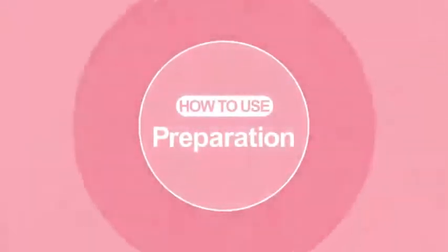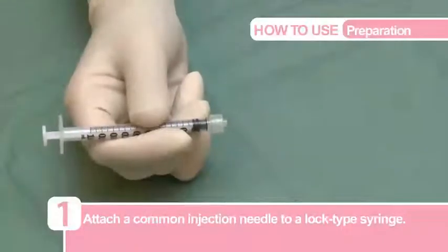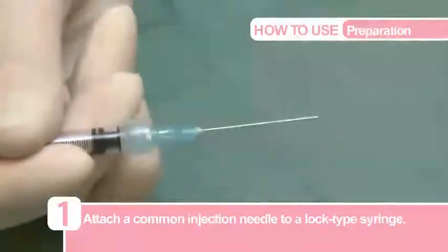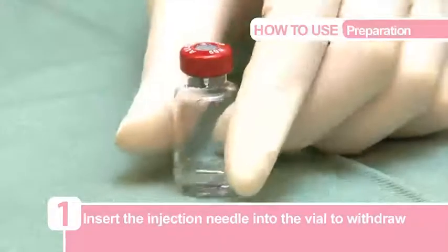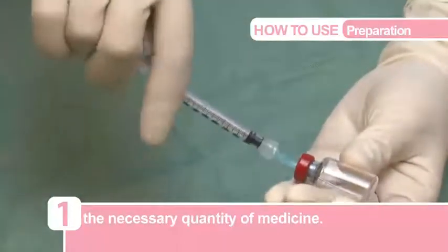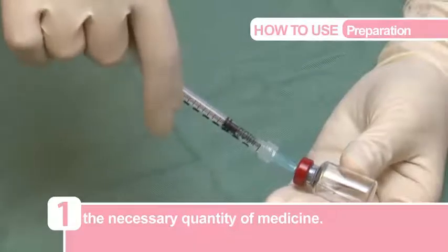Now let's take a look at how to use a Paskin unit. First, attach a common injection needle to a lock-type syringe and insert the injection needle into the vial to withdraw the necessary quantity of medicine. Please make sure to use a lock-type syringe.